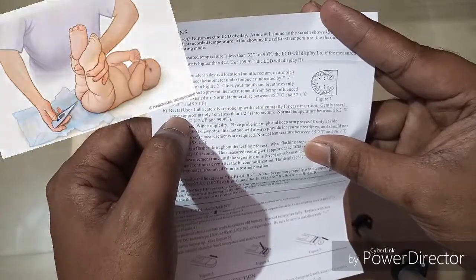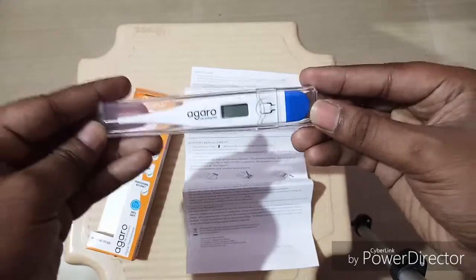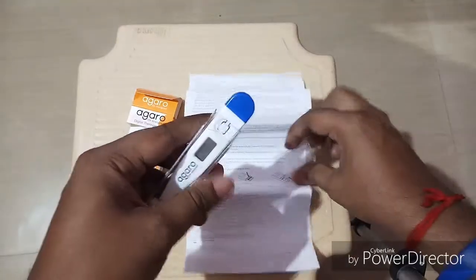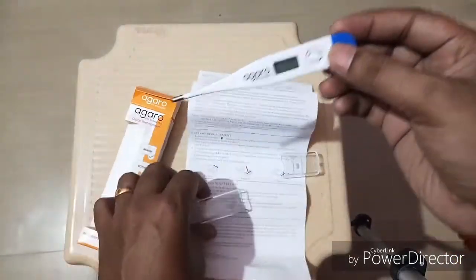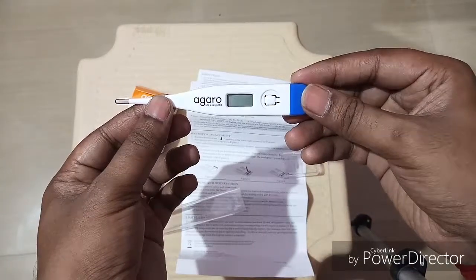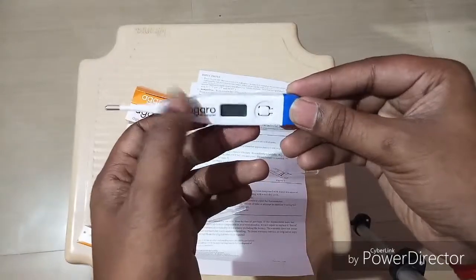Now let's look at the thermometer. It comes inside a glass box with a cap that you can open. You can see there is one LCD display, one on/off switch, and the probe. The blue side is the battery compartment.